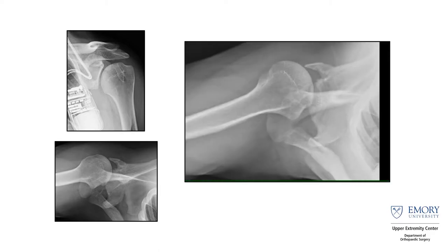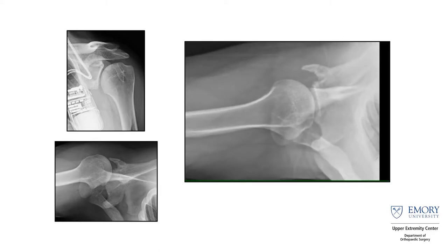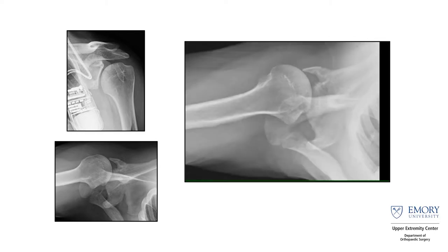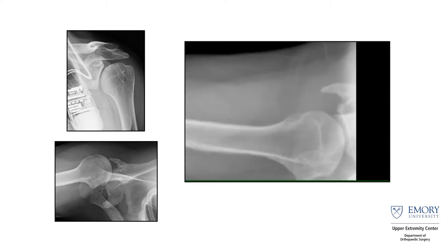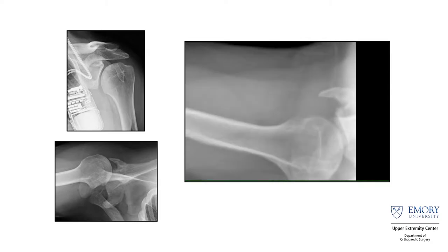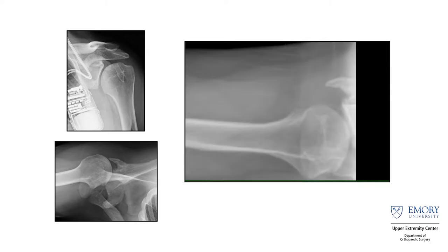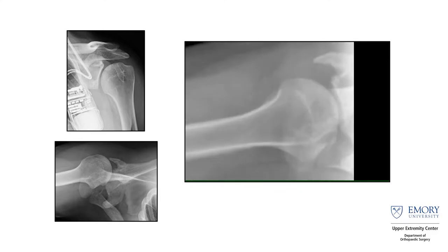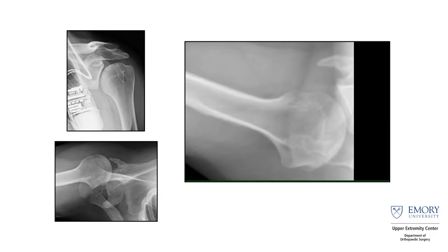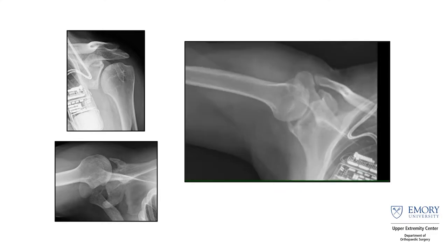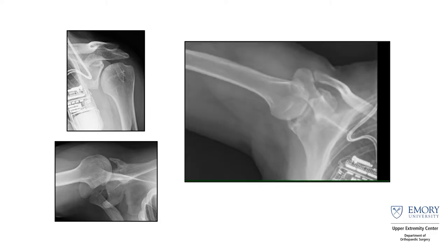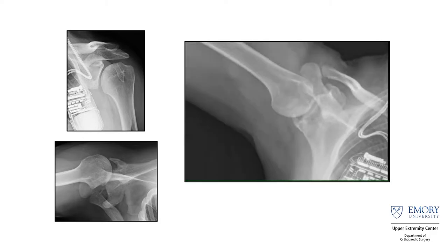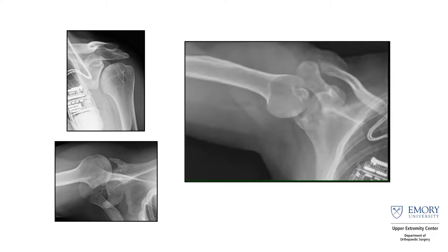You can legitimately see his shoulder subluxing from inside the glenohumeral joint, then out posteriorly, back into the glenohumeral joint, and back out posteriorly where that bony Bankart lesion is. On multiple views you can see how his joint is subluxing from inside the glenohumeral joint out posteriorly to where that prior bony Bankart was — probably from one of his 100-plus dislocations. You can also see this on the Grashey, how he subluxes posteriorly and gets caught during internal and external rotation.